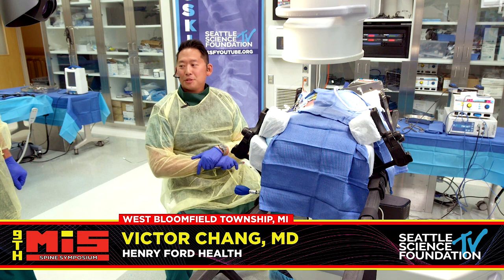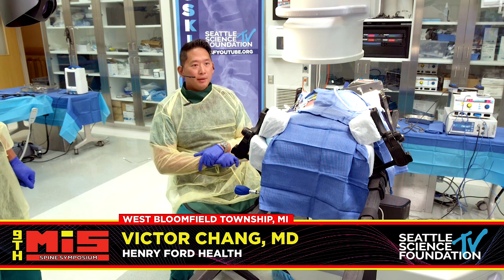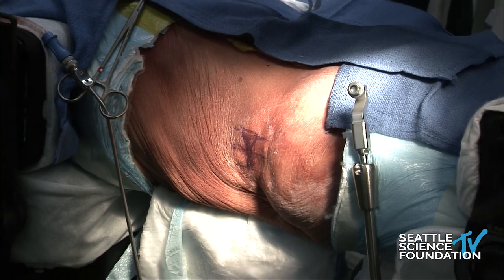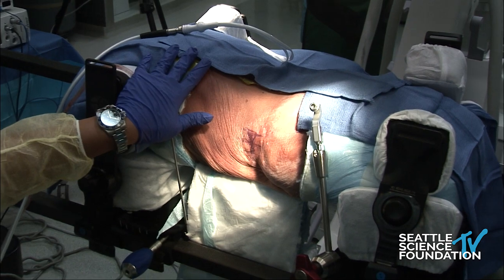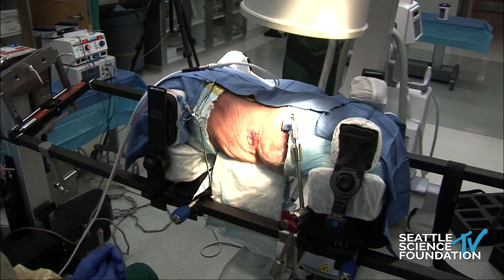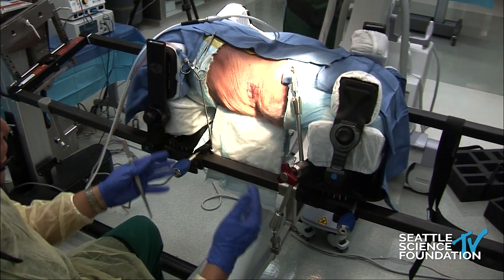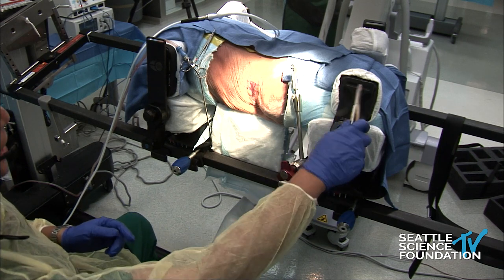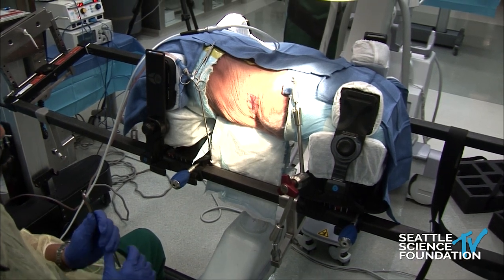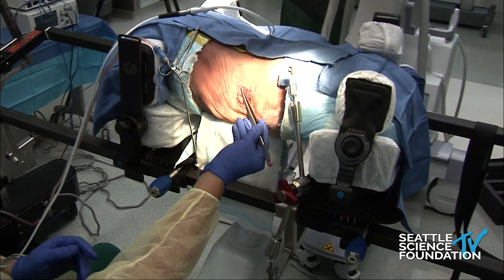This is the future of sitting — the prone lateral position. We can switch the camera to the view behind me so we can see how the patient is positioned. Rostral is here, caudal is here. This is the special positioner that fits on the Jackson table. You'll see these little knobs — you get some coronal adjustment with this system, and there are pads with straps available so you can get a little coronal tilt to open up the space. We also have our retractor arm that we're going to use in a second.